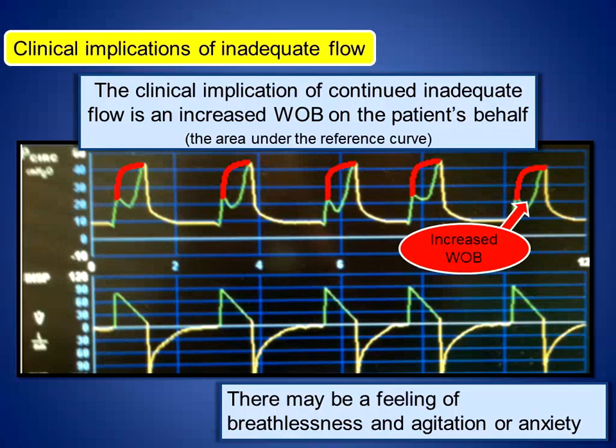And I think if we're honest with each other, how we correct this a lot of the time isn't based on the ventilator, because the patient is anxious and agitated and all over the place because they feel like they can't breathe. And if we're honest, that patient gets sedation. And this isn't a patient problem. This is an us problem. This is a you problem that you have to fix. And we, unfortunately, use other means to fix this. We fix the patient instead of the machine.